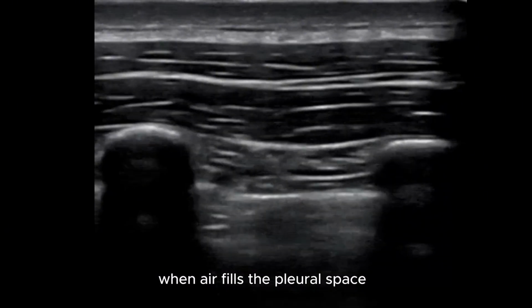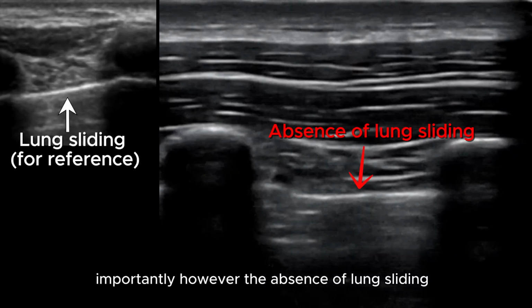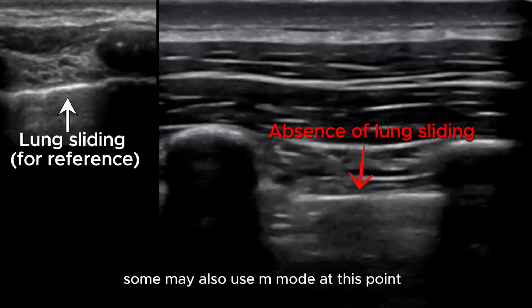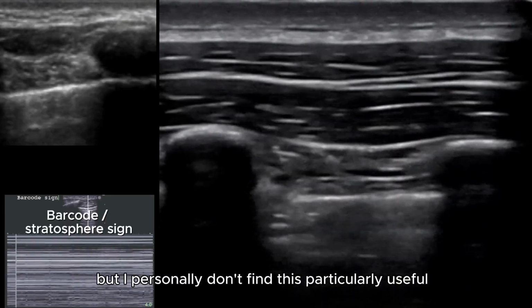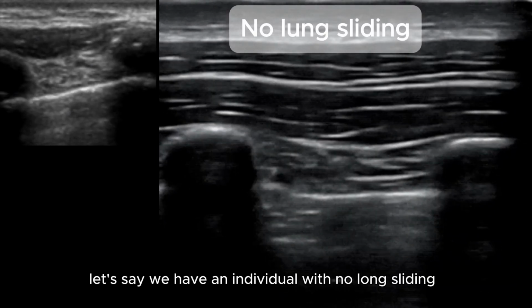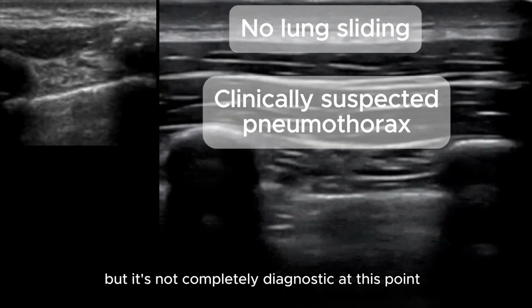When air fills the pleural space, the normal lung sliding is no longer apparent, as demonstrated here. Importantly, however, the absence of lung sliding is not diagnostic of a pneumothorax. Some may also use M-mode at this point to look for the barcode or stratosphere sign, but I personally don't find this particularly useful. So now, let's say we have an individual with no lung sliding and a fitting clinical context for a pneumothorax. We have a high suspicion on the ultrasound for a pneumothorax, but it's not completely diagnostic at this point.